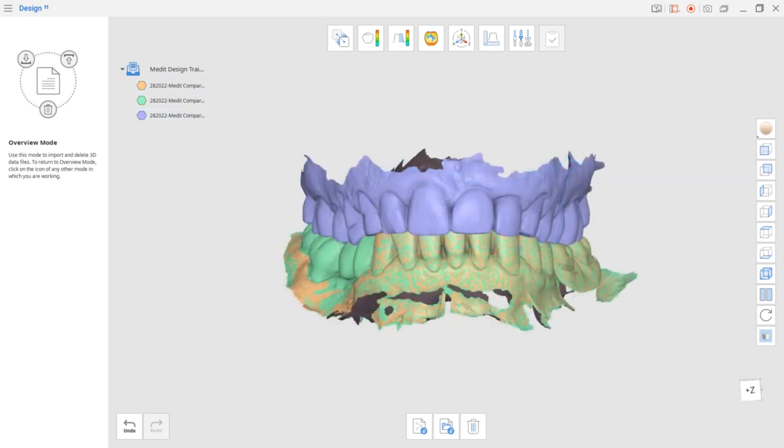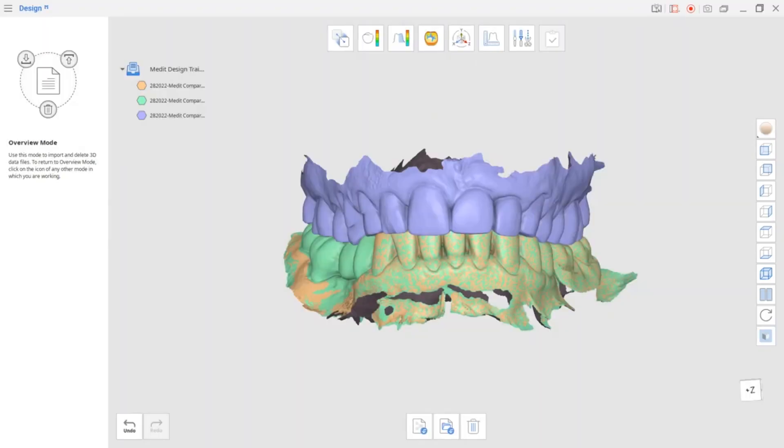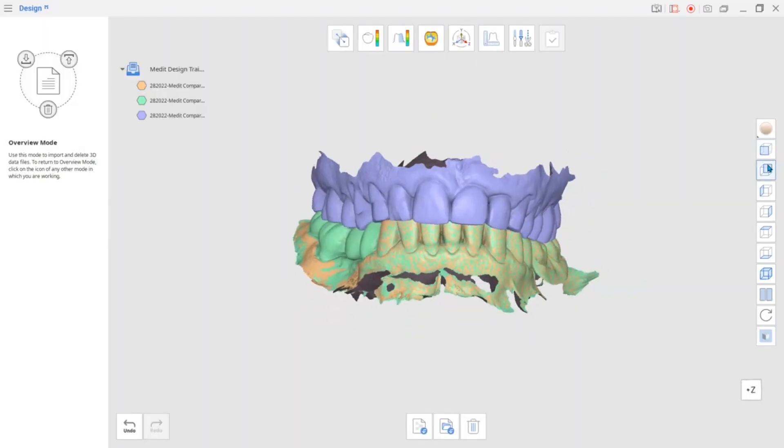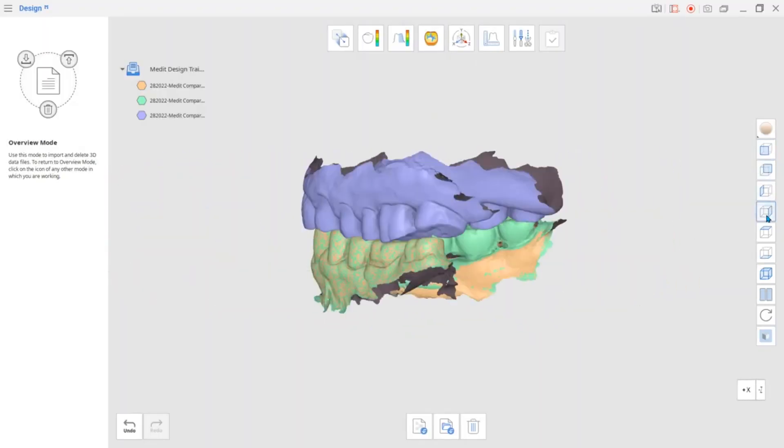In the side toolbar, you will also find different axis view options for easier rotation and examination of the data.